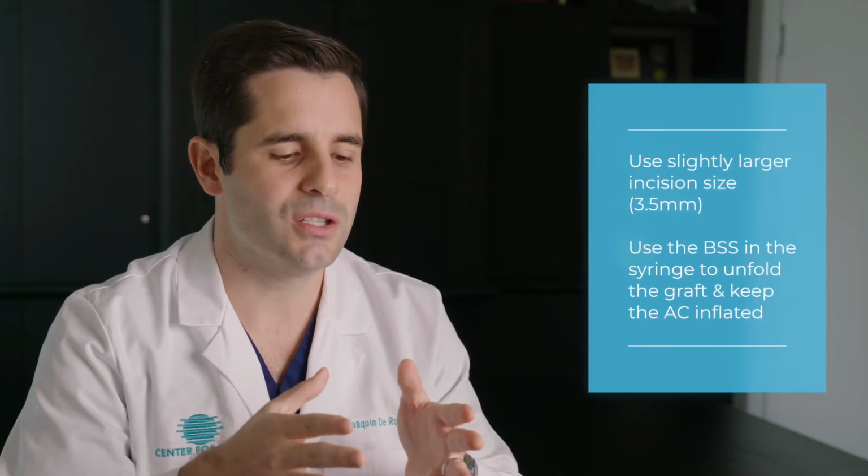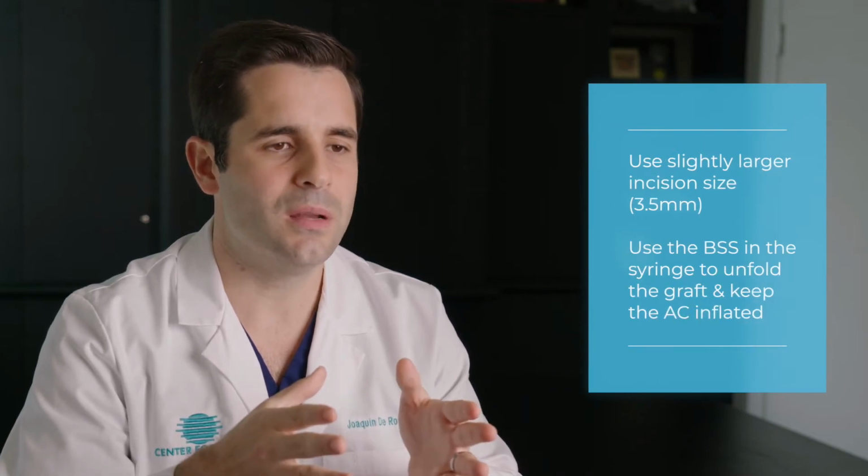You should consider incision size as an important factor. You want the incision, I think, slightly larger than the minimum 3.2, closer to 3.5, because that allows the anterior chamber to inflate when you're injecting the graft. You're going to keep the injector in there to keep inflating the AC, because that is your AC maintainer, and you're going to let the graft unfold. But you're also not making the incision too tight, so there can be some fluid egress out of the eye so that the pressure doesn't build up too much. And that will allow it so when you pull out the injector, there's not a high pressure system where everything's rushing out of the eye.